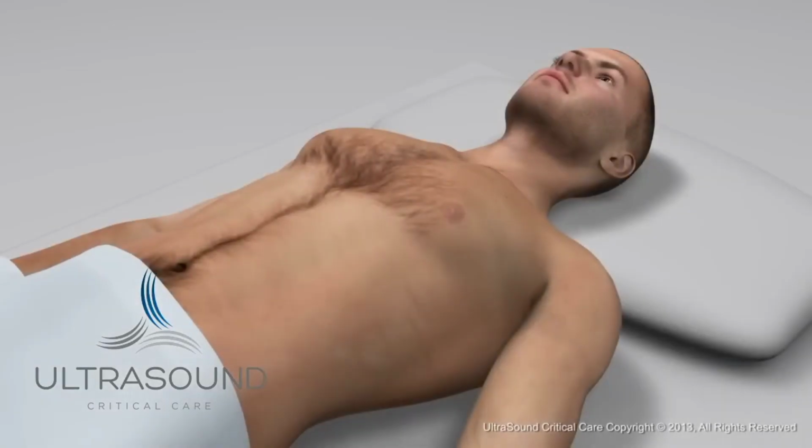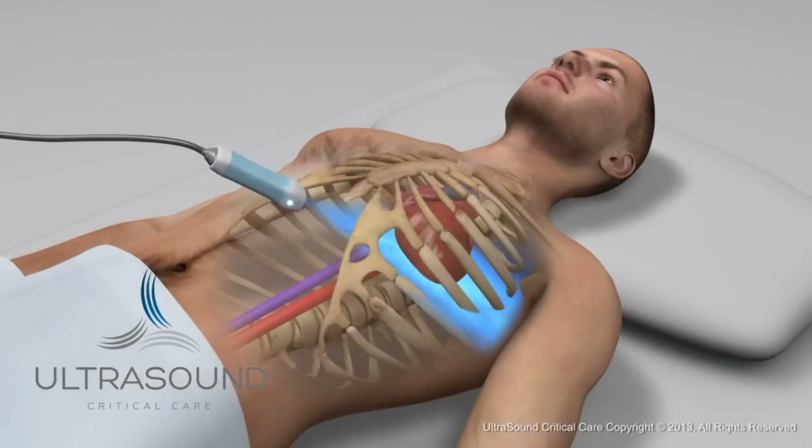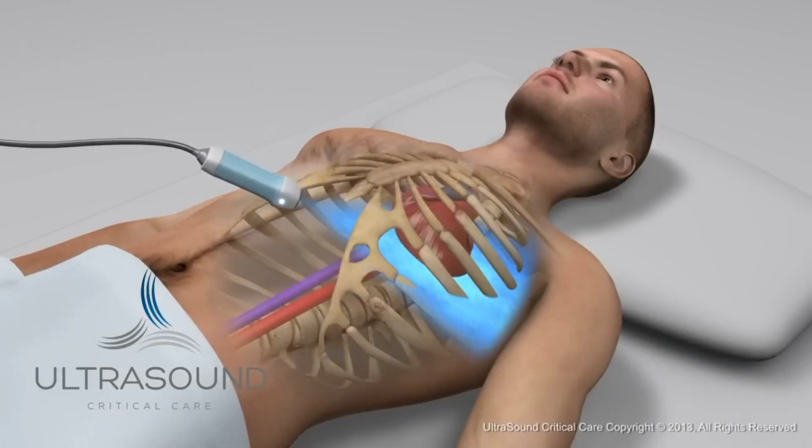Subcostal long axis view. Place the probe at the subcostal area with the dot aiming directly to the patient's left side. Press the probe down and angle the probe up and slightly to the left.